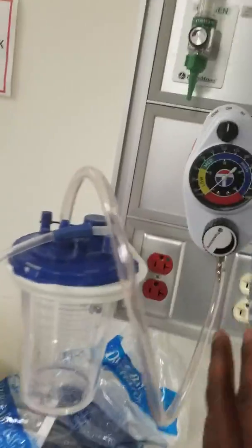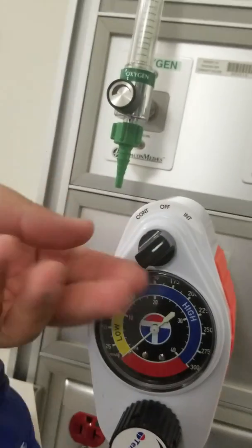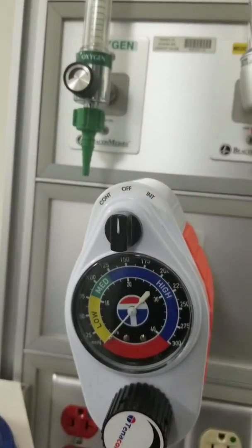Off and what else? Continuous and intermittent. Okay, so I have to make my decision. What do I want him on? Continuous. Okay, familiarize yourself with this.